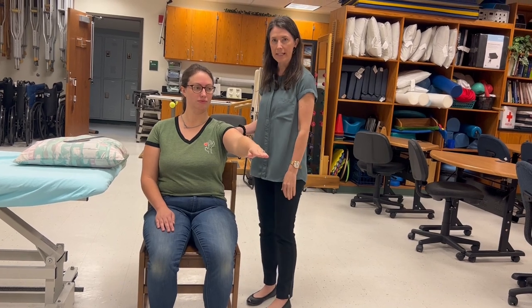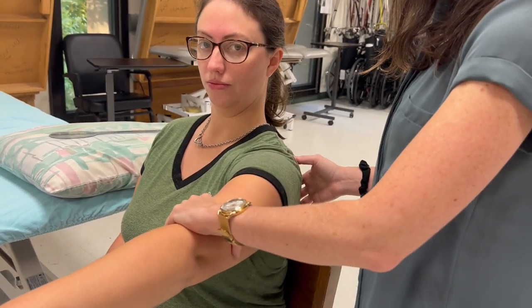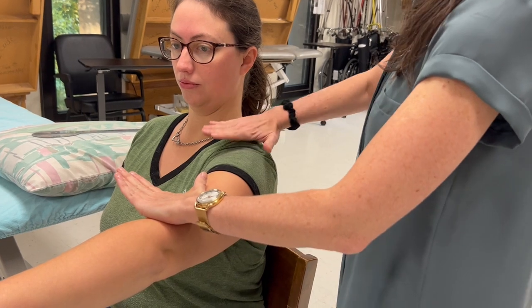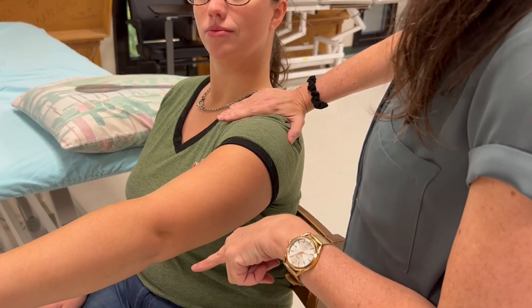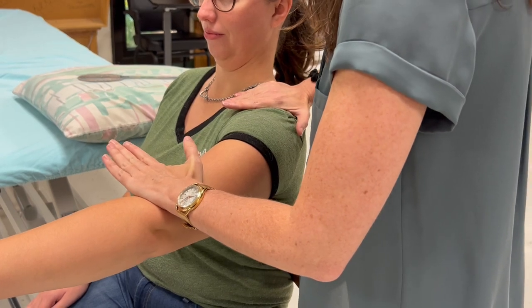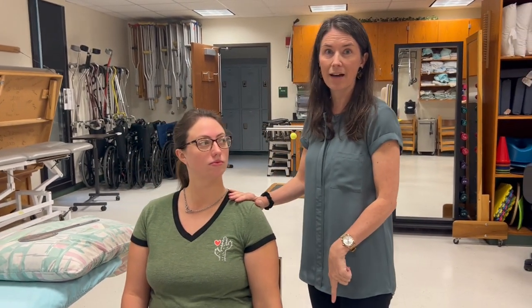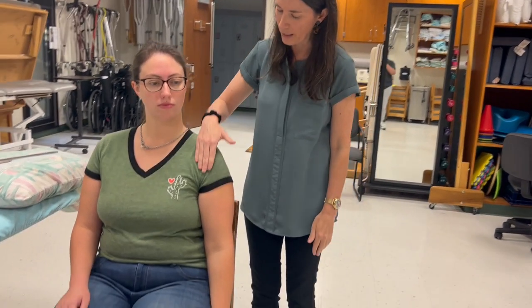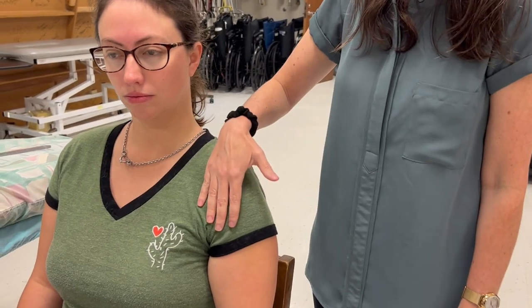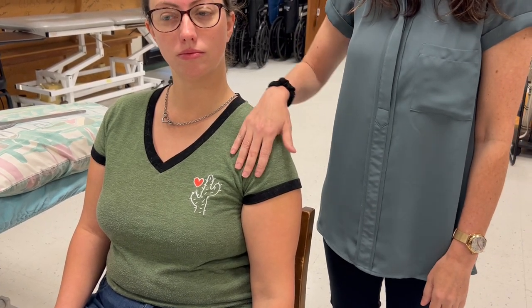She did her three, so now I'm going to provide resistance. My resistance hand is on the distal humerus just proximal to the elbow - not wrapping around, just my palm. My stabilization hand is on the ipsilateral shoulder at the top. I'll say I'm going to try to push your arm back down, don't let me do it, stay strong - and then I push. That's your four and five. Grade two is partial range. To distinguish between a one and a zero, I palpate on the anterior shoulder where the shoulder flexors are - if I feel anything under there I give her a one, and nothing means a zero.